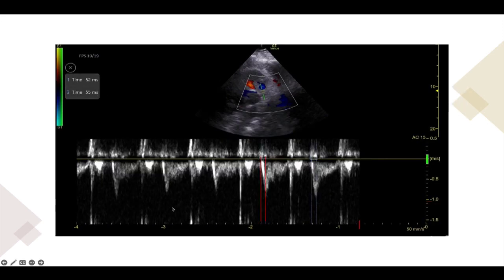In this case, same idea, we have our parasternal short axis, and then we're pretty much bringing, this is our Mercedes sign right here, we're bringing that pulse wave cursor right here to the pulmonic valve, and then we're measuring from the beginning of the wave all the way to the peak, and it'll give you a time, in this case was 55 milliseconds, I'm sorry. So that will also be a sign of an acute process.